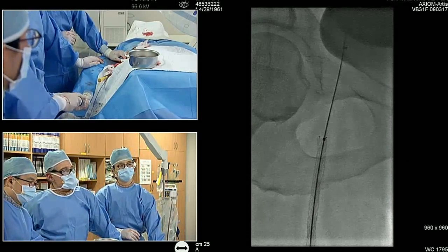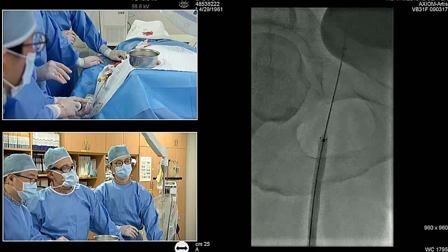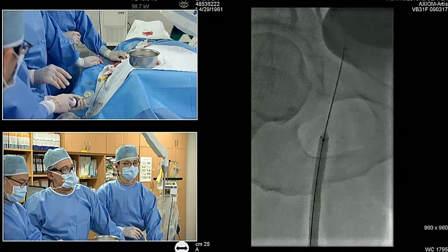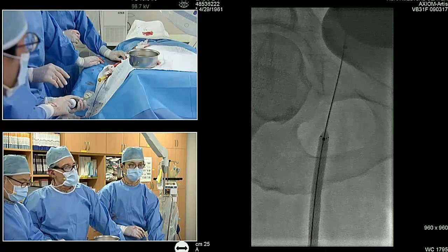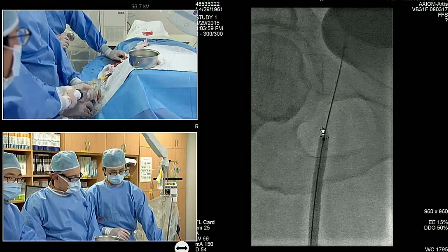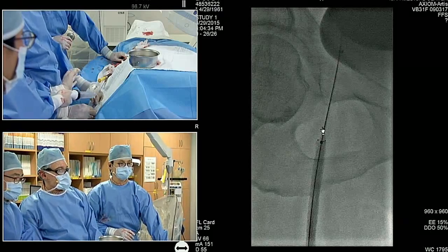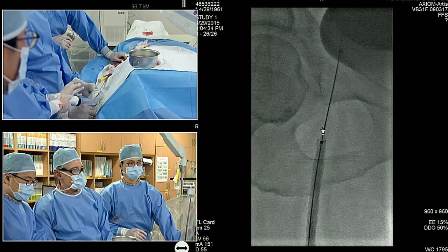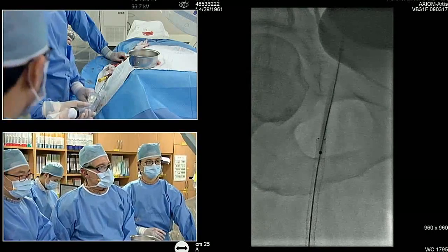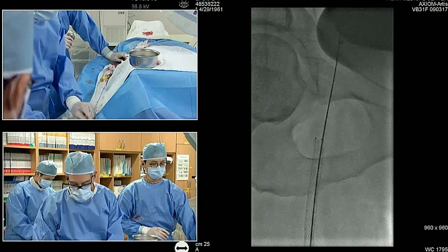Okay, up we go, just like 4, 6. Because the balloon is longer than the stent. And 6, I think it's okay. Good. Okay, store that image. And down. And we can post-dilate some more if need be, but I'll just take this out to give you a picture because it's right before closing time. Sounds great. Okay, we'll take this out. Go ahead and finish it up.